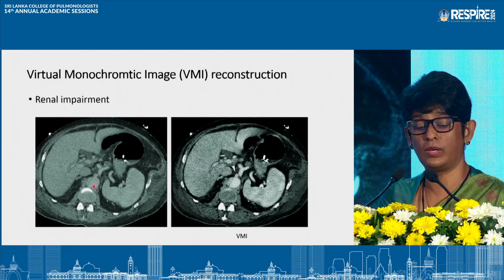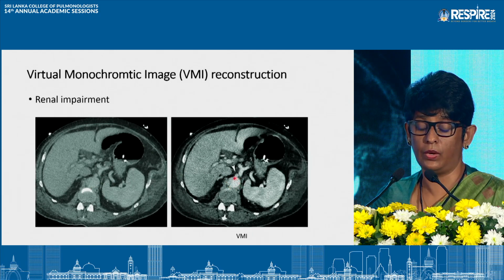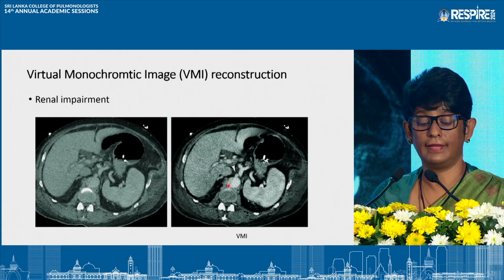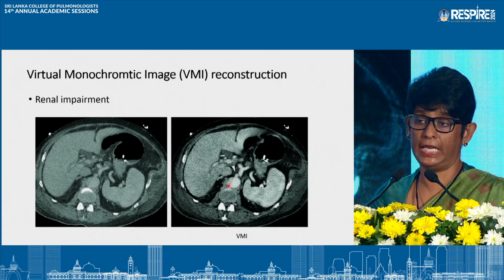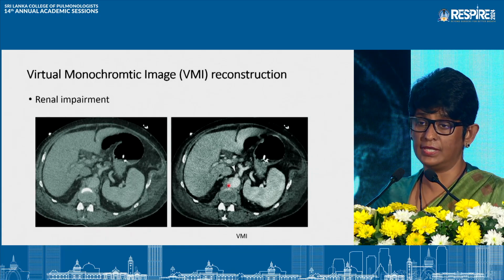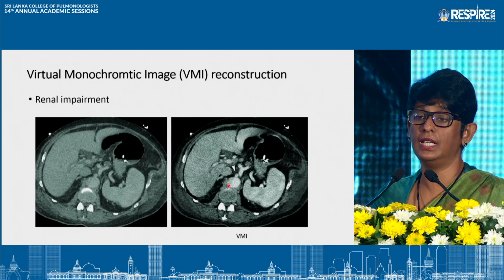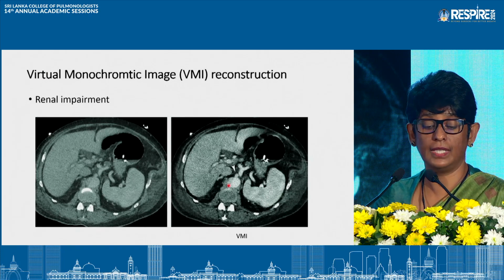the aorta. And they have been reconstructed using VMI. Now we have adequate contrast density in the aorta, and we can well see the chronic dissection. So the bottom line is, patients who are in renal failure can have dual energy CT studies with significant reduction in the contrast administered, and the kidneys can be spared.